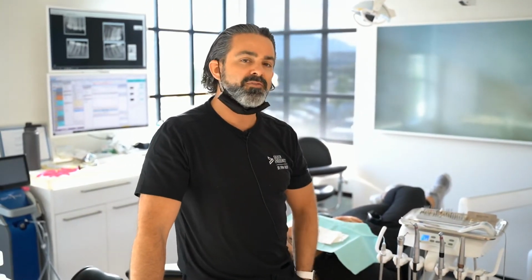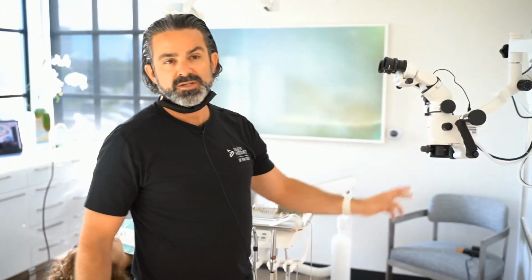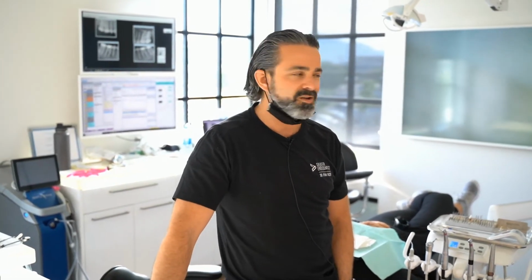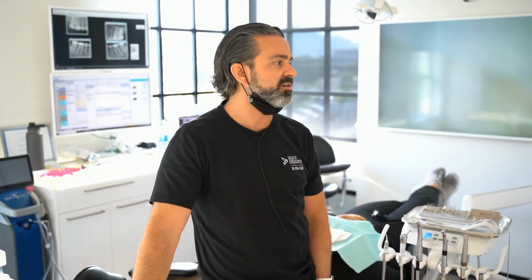I don't think parfocaling, as long as you get these varifocus features, is an issue. It's mindless. It's like riding a bike. It's just tying your shoes. It's nothing that I even consciously think. You can probably hear me struggle even explaining it, like how do you explain making a peanut butter and jelly sandwich? If you really listed all the steps, it's hard to do. It's just intuition, and there's not really a learning curve there.